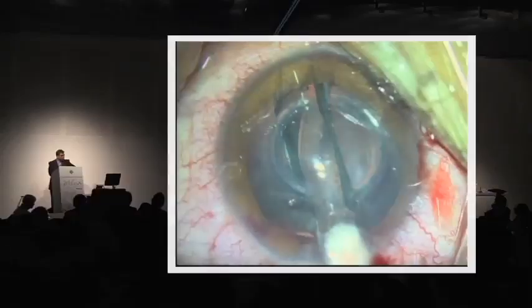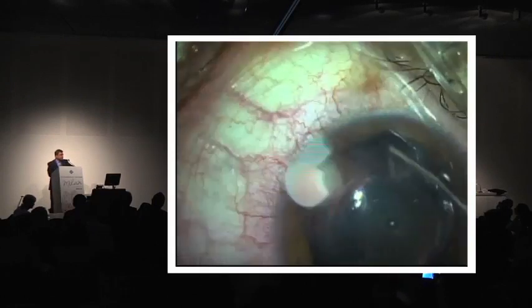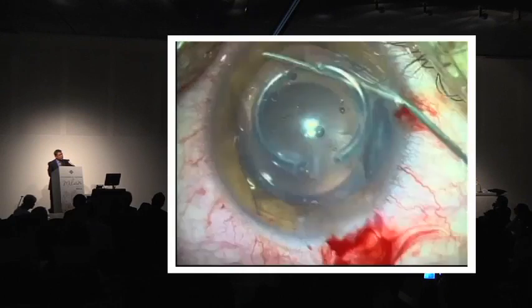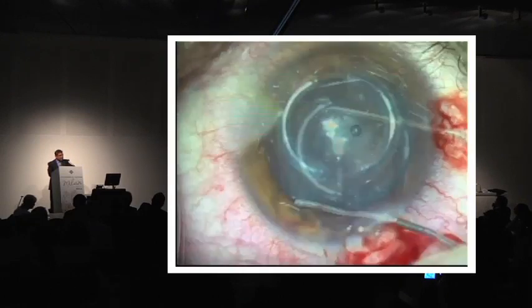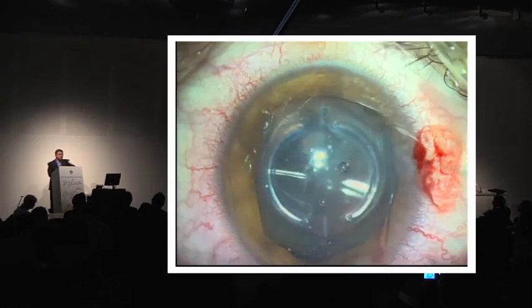I have experience using the combination of the intracorneal rings and the ICL. What we suggest is first to perform the corneal rings, and whenever we have a stable topographic and refractive result, which is probably achieved 6 months after the procedure, you can go ahead and use the anterior chamber or posterior chamber phakic IOL of your choice in order to treat the residual refraction of these patients.